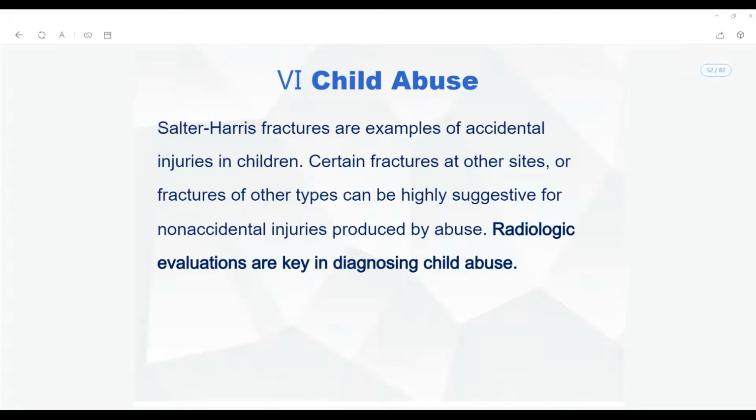Okay, look at the picture. You can understand, right? See, look at all the pictures.